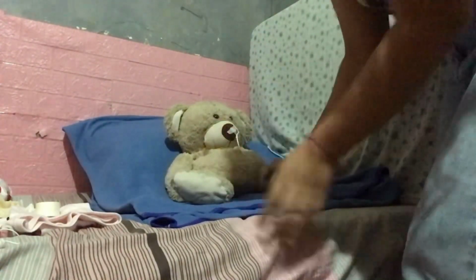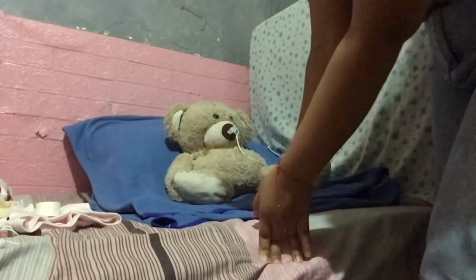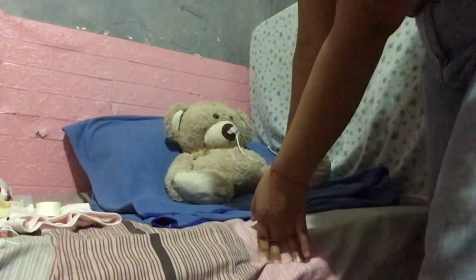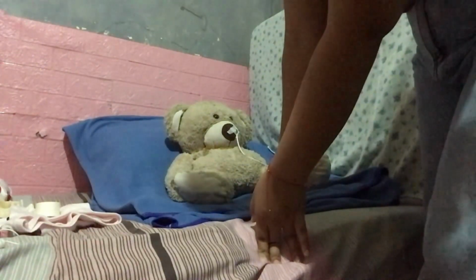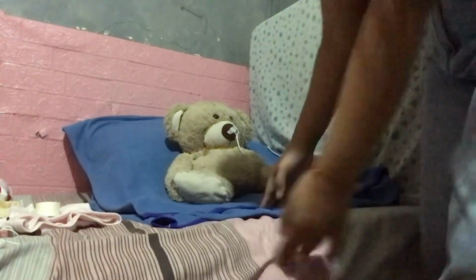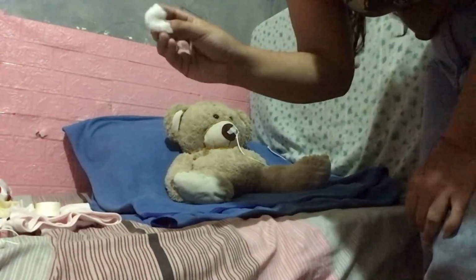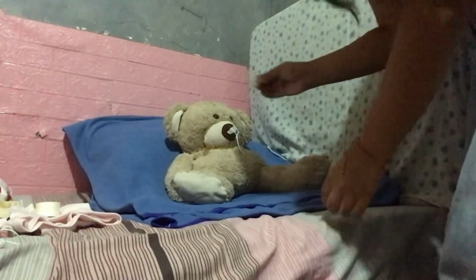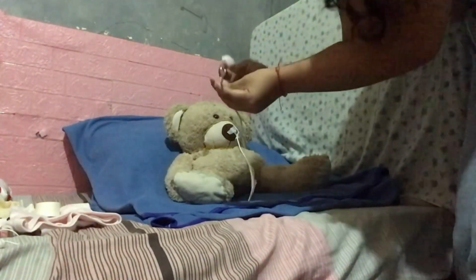So using an antiseptic solution, clean the penis and surrounding area, starting at the urethral meatus and moving outward in a circular motion. Use a new cotton ball or gauze for each stroke and work from the cleanest area towards the dirtiest. So imagine these are the cotton balls with antiseptic solution. So for example, this is the private area of the patient.